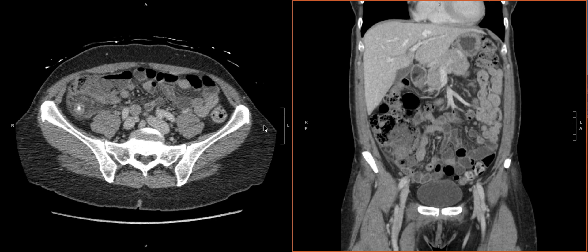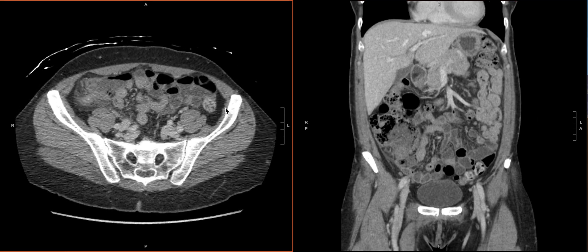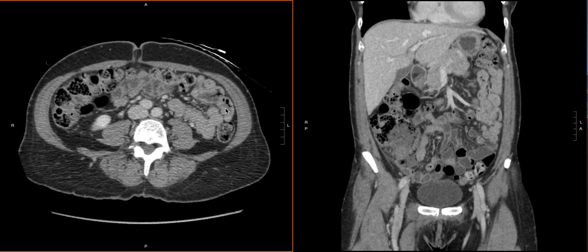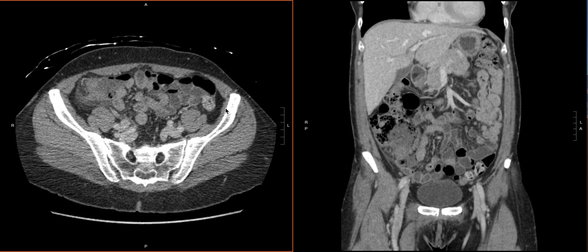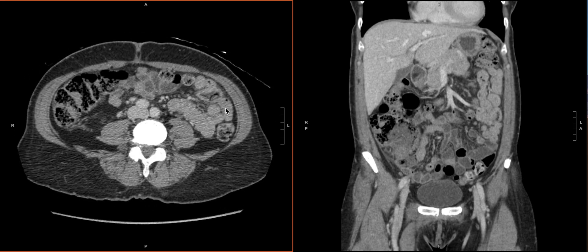In this video, we're going to talk about the dedicated search pattern that we will use for a CT scan of abdomen and pelvis to evaluate for acute appendicitis. The cases that we're going to go through in this playlist are acute uncomplicated appendicitis, so we will start with the basics.